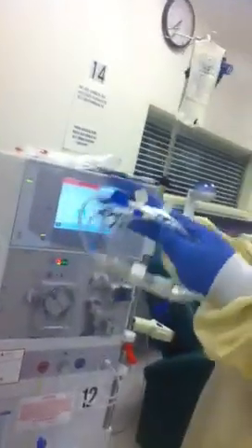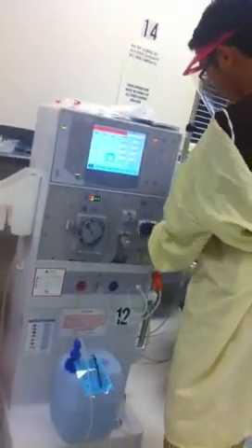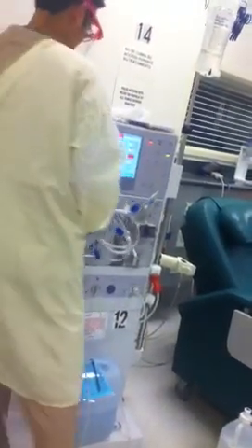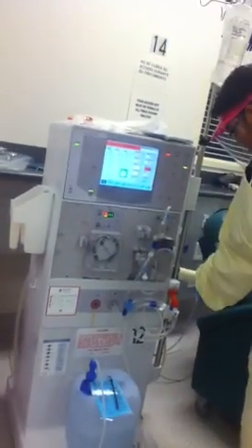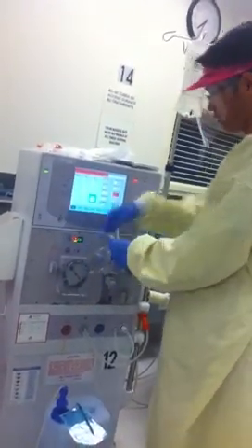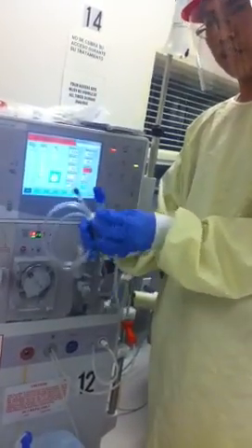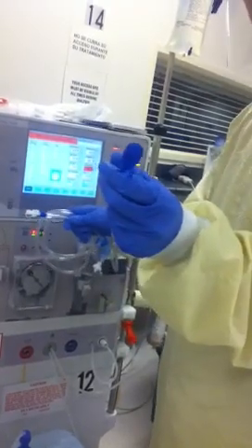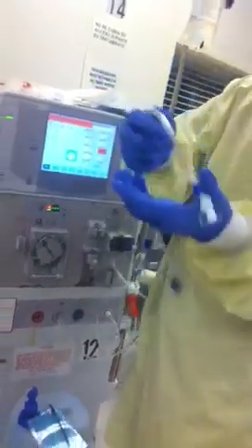Now we're going to connect the lines. First is the venous line. This one goes here. Dialyzer. So when you put the dialyzer, make sure that this one is at the bottom. You need to protect these two things, the port that goes to the dialyzer and the port that goes to the patient. So make sure that they will not fall, because they need to be sturdy. Now let's connect this one to the dialyzer. Then this one into the back.